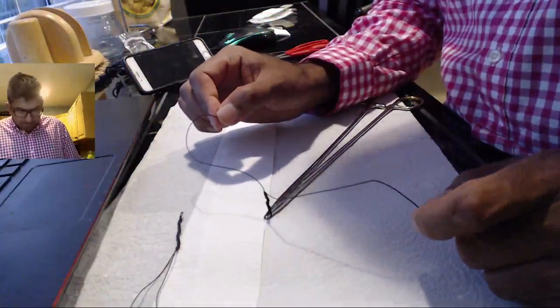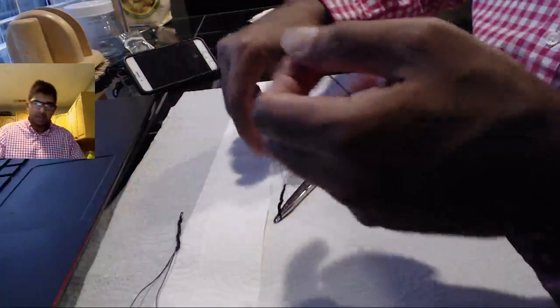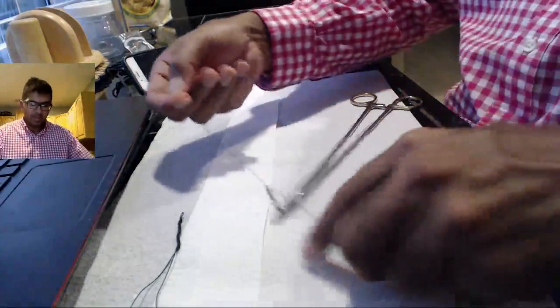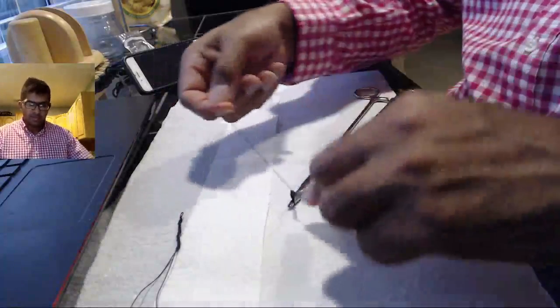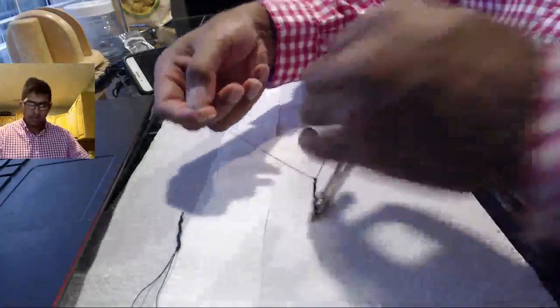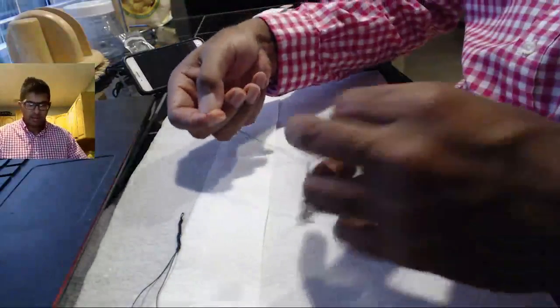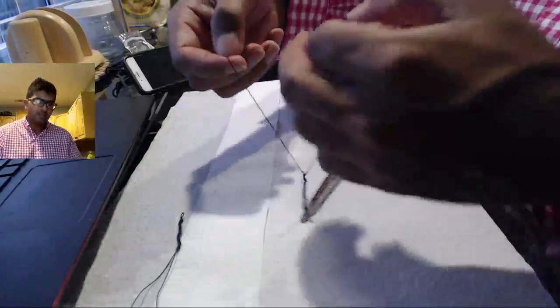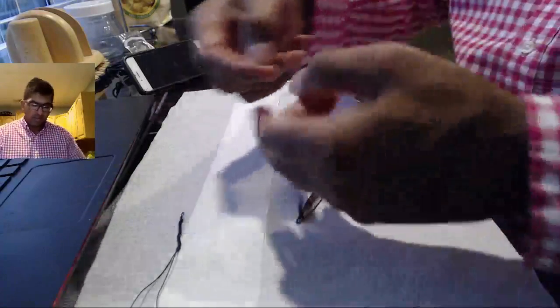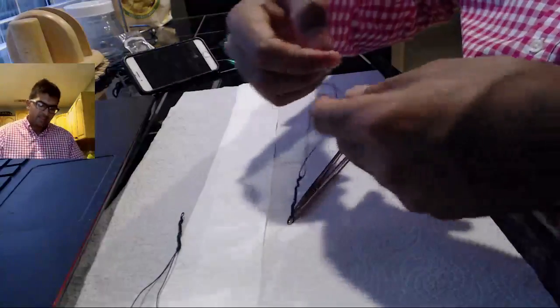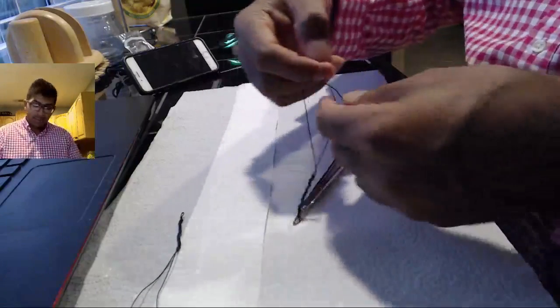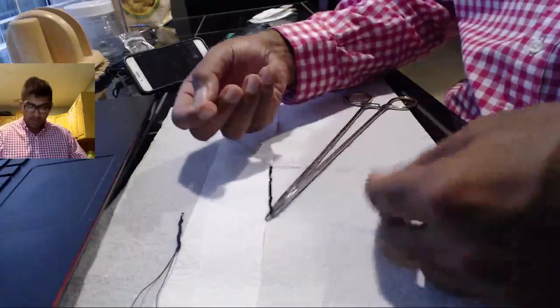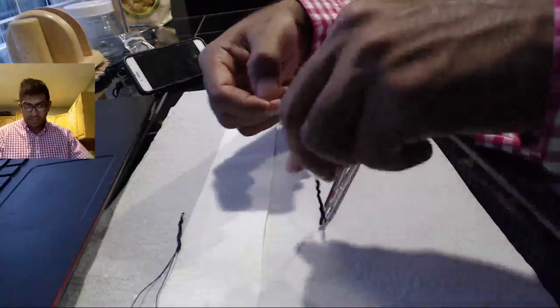Now, other things I wanted to mention about knot tying. When you go for speed, you'll notice when I try for speed, it becomes a little bit not so smooth. And if I continue to go at this pace, I can probably get 38 or 40. But again, it really loses that fluidity. And what I want to teach you guys is how to get so you look smooth while you operate. And the reason for that is, the better you look operating, the more your attendings or senior residents will let you do. If they ask you to tie a knot as an intern, and you can put down 10 or 15 and it looks good, guess what? They're going to let you do a lot more. If you're a medical student and you can tie knots, I'm not sure they're going to let you. But if you can, that's really going to surprise them. And you know what? They're going to ask you to tie knots.